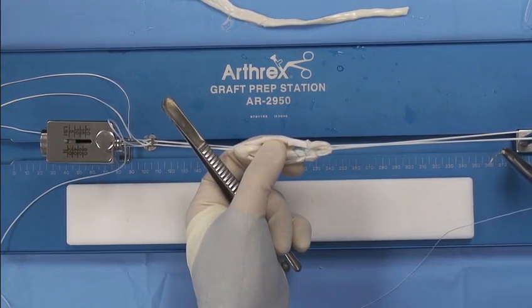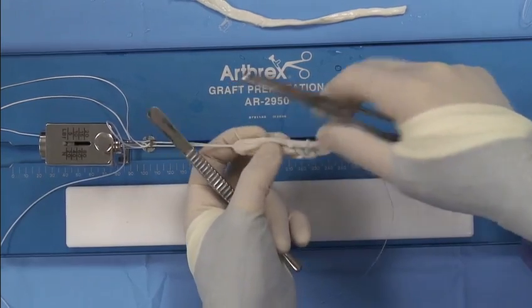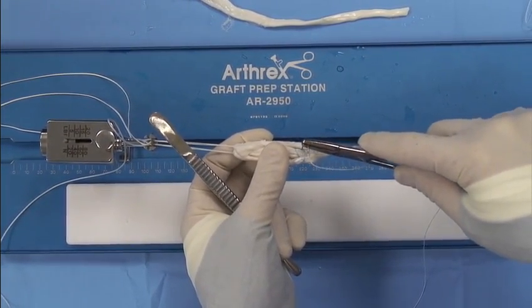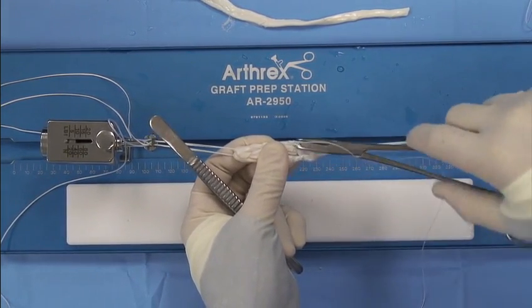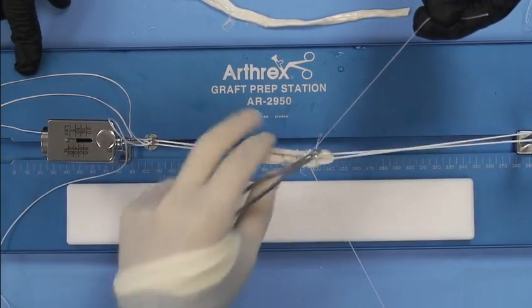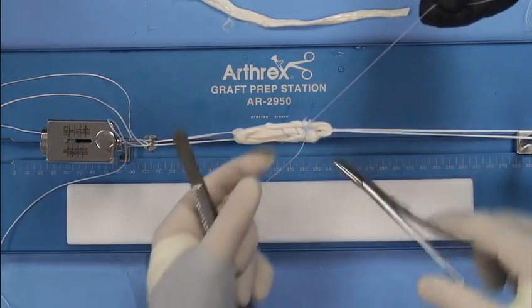I'm going to take my number zero fiber wire and do it one more time with the buried knot technique. I'll make sure I come in through all four strands but with the buried knot. So there's number two, number three, and number four. And then you'll have two on this side which is the tibia side, which is really going to secure the free ends.